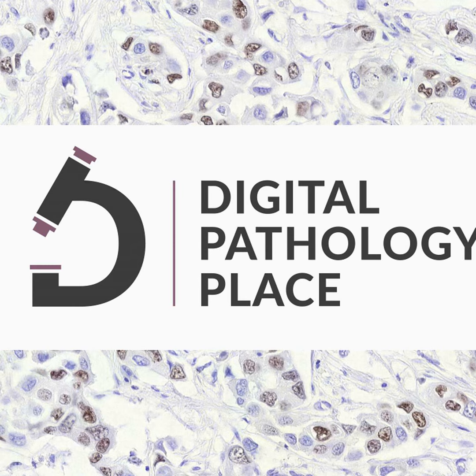What would be the steps on the pre-processing side? On the pre-processing, as you know, histopathology slides are very big. So we need to do the tessellation and the normalization, so that all the histology tiles and the slides look similar. And then maybe there could be some feature extraction with the new SSL methods, like transformer-based feature extractors. This is all in the pre-processing aspect. So you go from whole slide image to the features, everything locally.